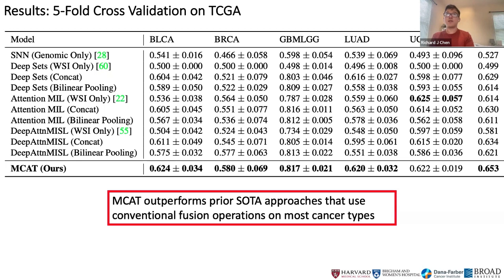So in terms of overall strategies for multimodal fusion, whether it's for clinical purposes or for research, I think these strategies, like late-based fusion, or what MCAT does with the pseudo early-based fusion, would translate quite well for TMAs.